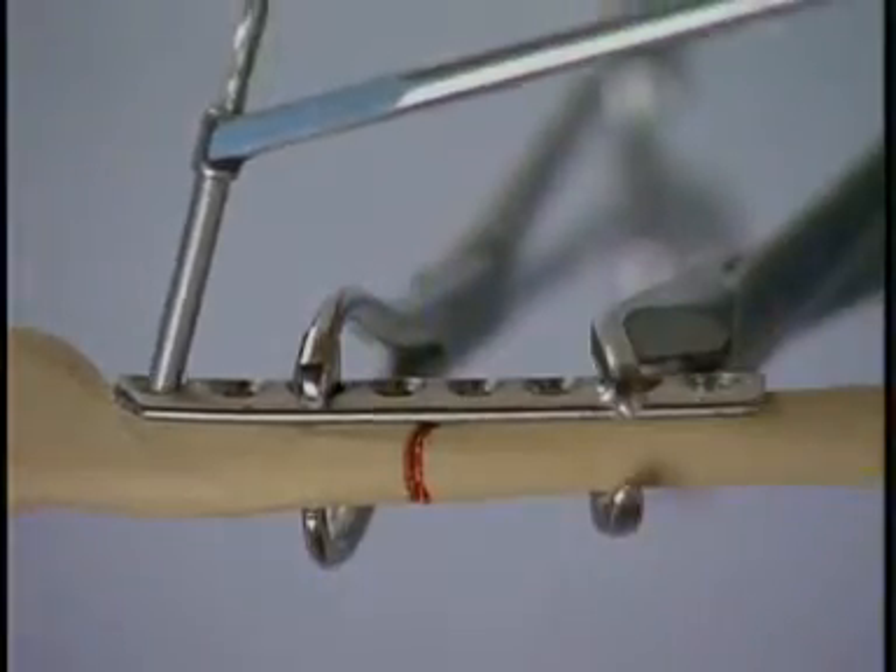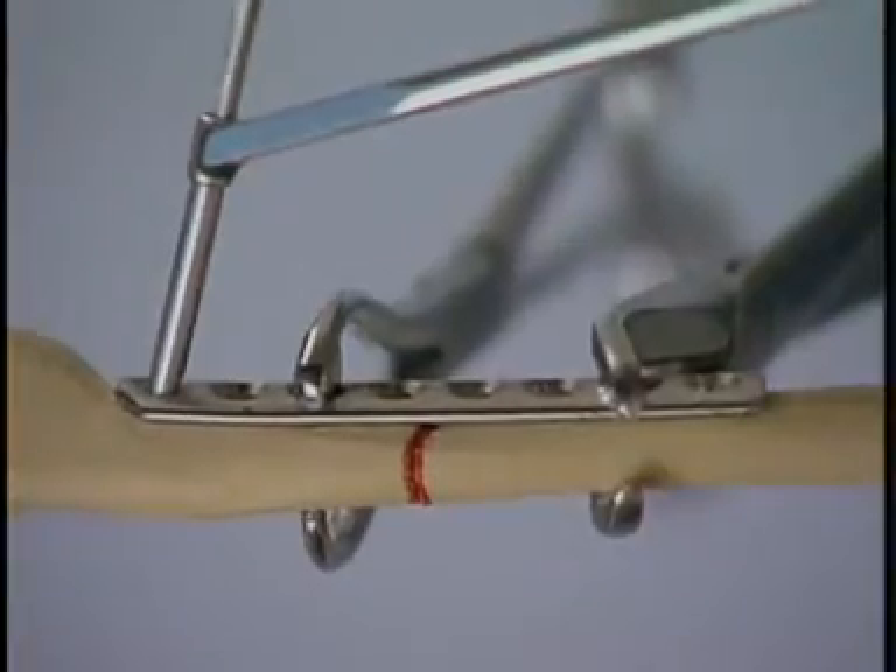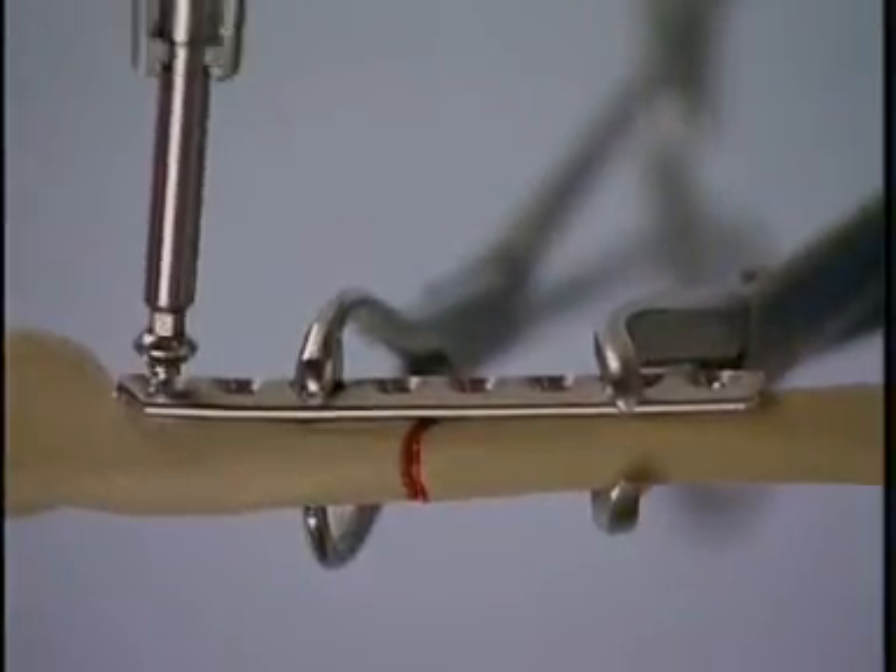The steps of drilling the hole, measuring the depth, tapping the hole, and inserting the screw are performed with each screw.